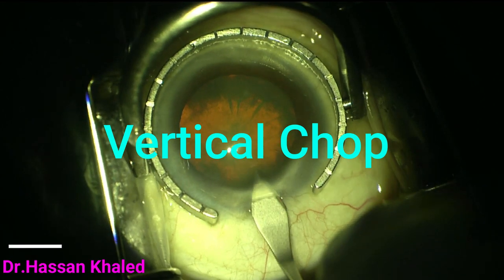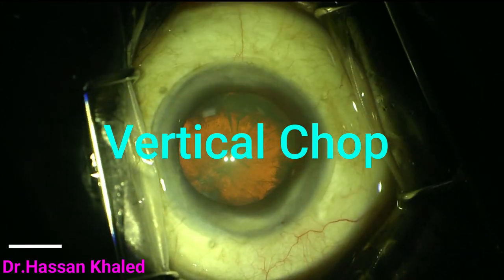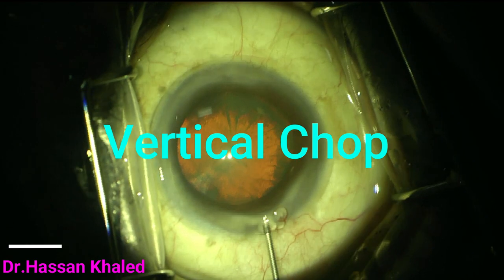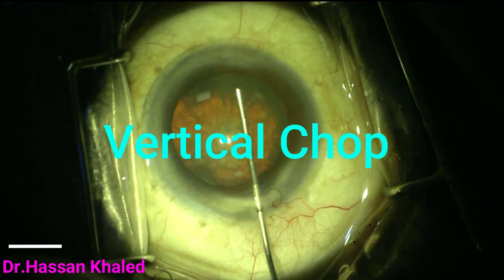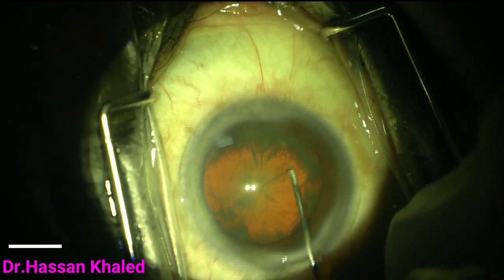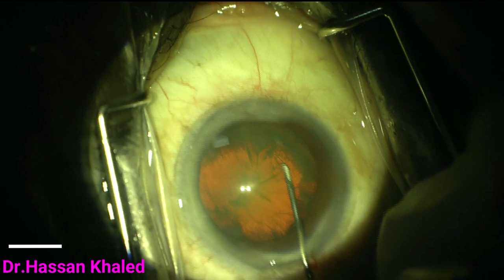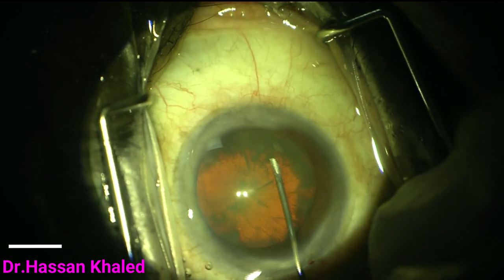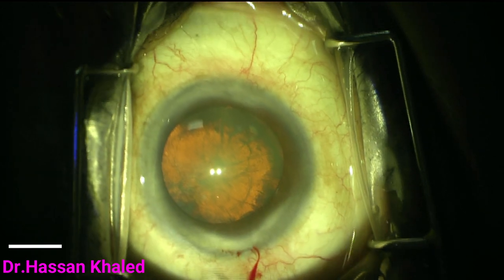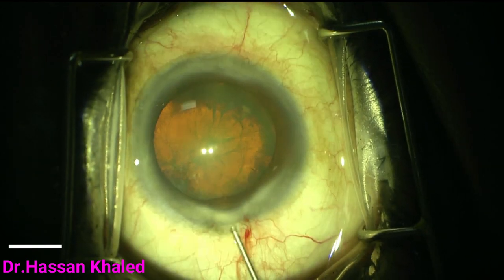I am going to talk about the vertical chop technique. This is a case of dense nuclear cataract plus three and more. I started with a 2.2 clear corneal incision, then filling the anterior chamber with OVD and starting the capsulorhexis, which is nice at about 5.5 millimeters.